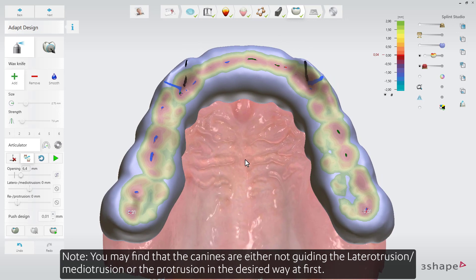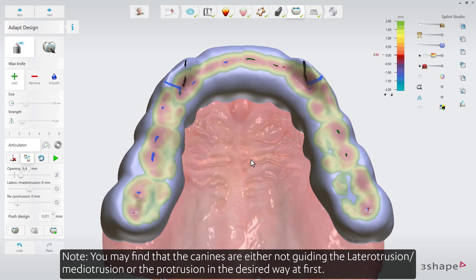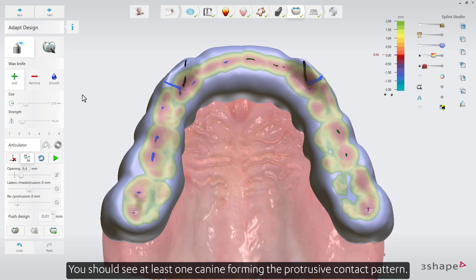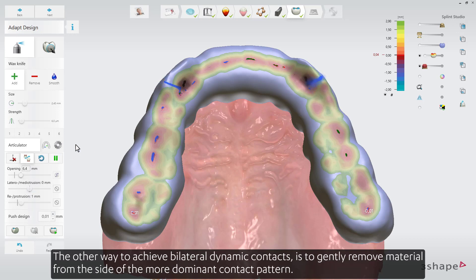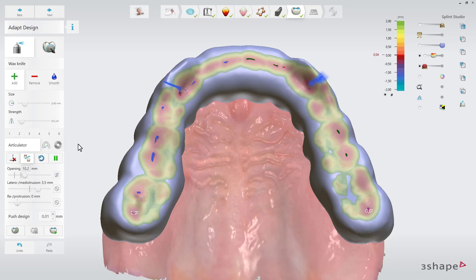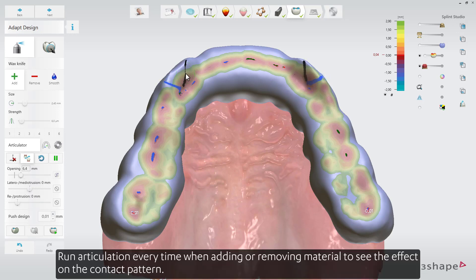Note: you may find that the canines are either not guiding the lateral protrusion and mediotrusion or the protrusion in the desired way at first. You should see at least one canine forming the protrusive contact pattern. To gain a bilateral opening pattern of similar strength, you can add material gently in areas where the contact pattern is weak or lacking. Alternatively, gently remove material from the side of the more dominant contact pattern. Run articulation every time when adding or removing material to see the effect on the contact pattern.